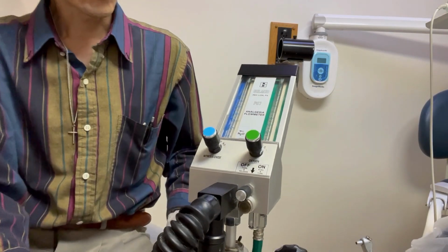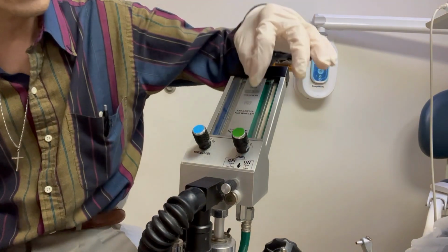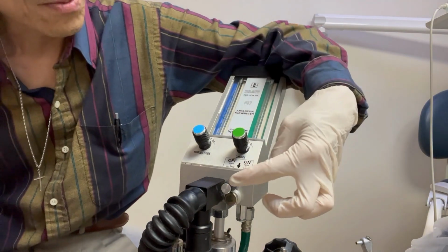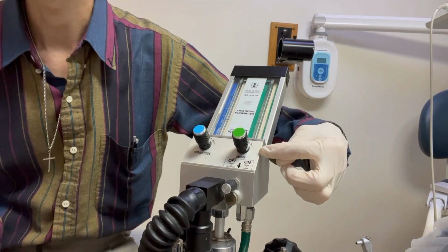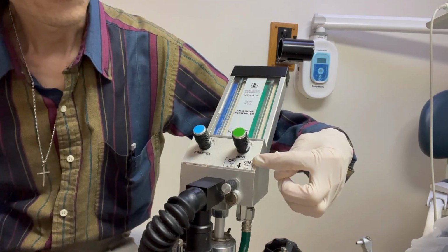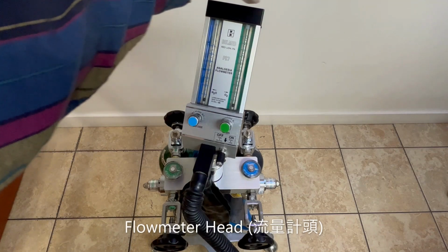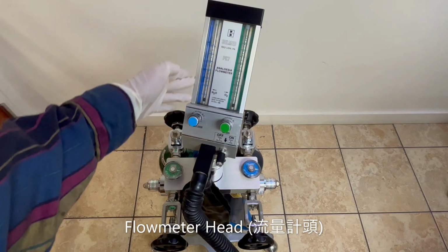On the top of the unit, you will also have a dial knob. This is the main valve that turns the gas on and off. This is the gauge, the meter.